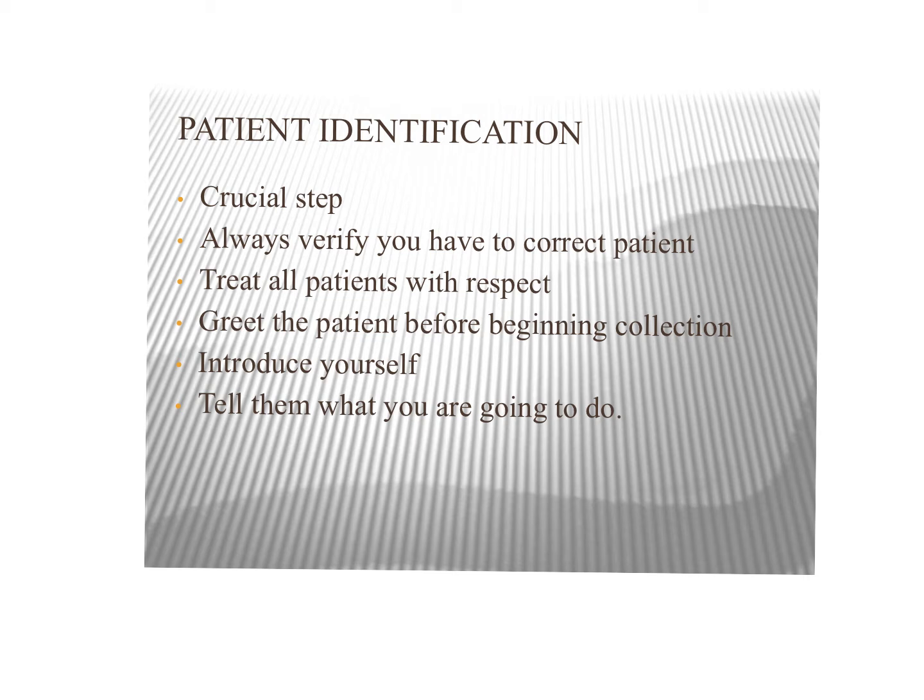We want to introduce ourselves. Tell them what you're going to do. Even if they've had their blood drawn a million times, we need to tell them what we're doing, greet them, and those types of things. We want to also introduce ourselves. So identify yourself, tell them your name, tell them that you're the phlebotomist, and then again, go through what you're going to be doing today.